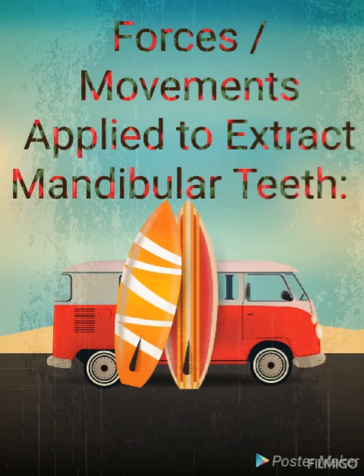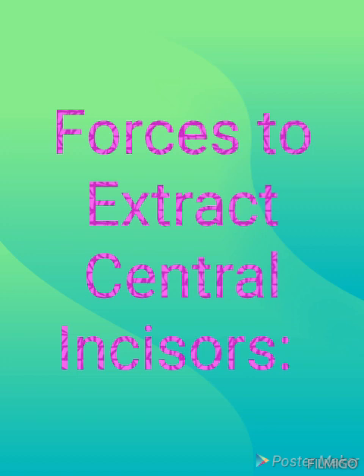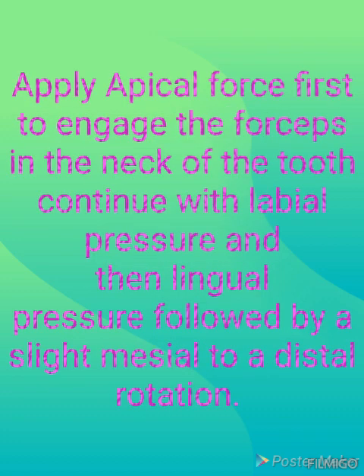Next we are going to see forces or movements applied to extract mandibular teeth. How will you extract mandibular teeth? The first one is forces to extract mandibular central incisors. How will you extract a mandibular central incisor? Apply apical force first to engage the forceps in the neck of the tooth, continue with labial pressure and then lingual pressure, followed by a slight mesial to distal rotation.